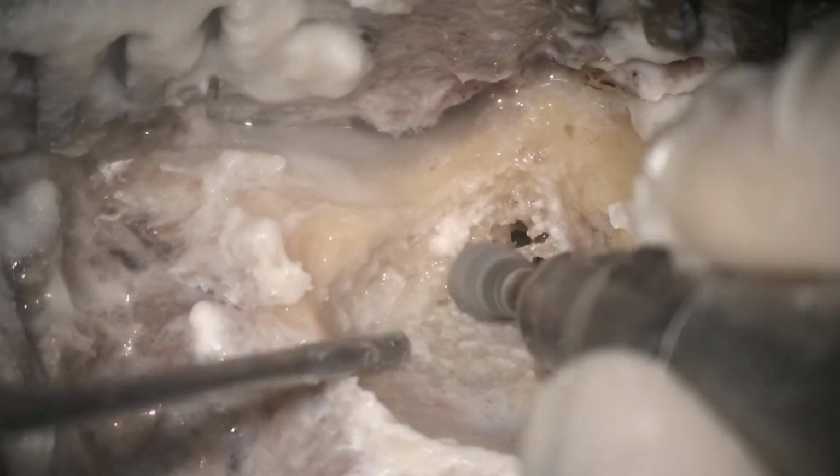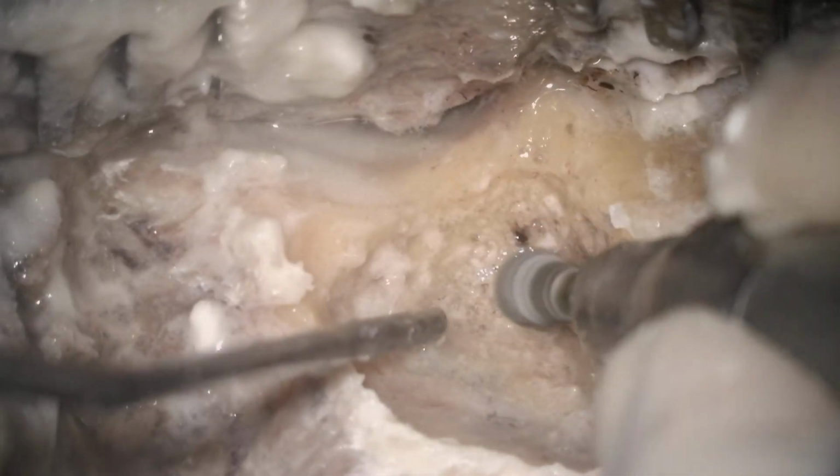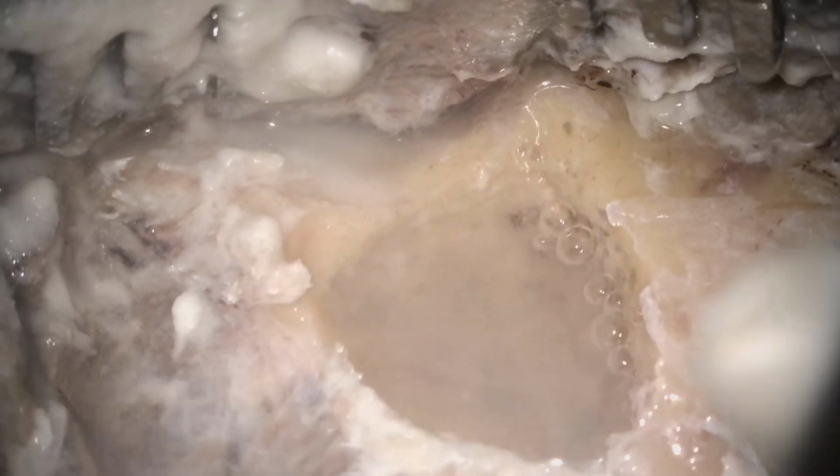Okay. So now we are opening the cells so that we can go into the mastoid antrum. The sucker is not functioning properly. It's blocked.